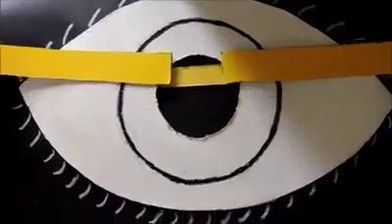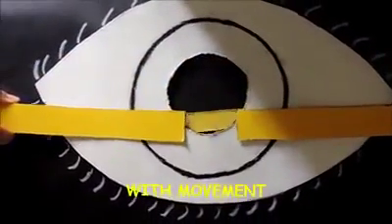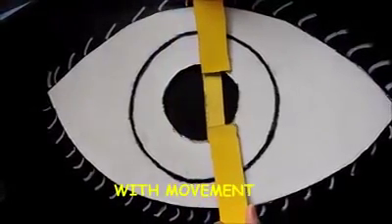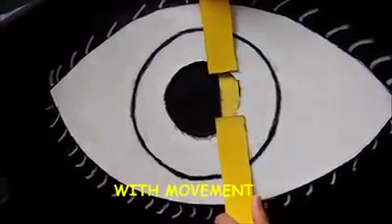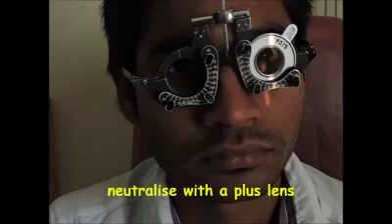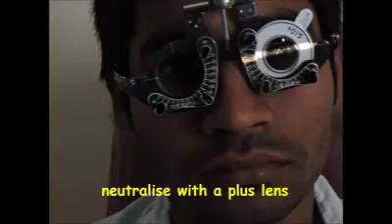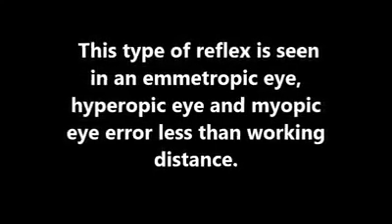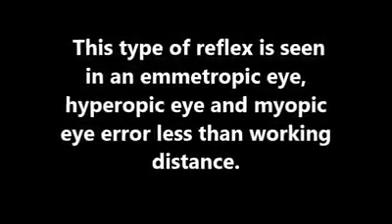Now, we check for the movement of the reflex, vertically as well as horizontally. If the movement observed both horizontally as well as vertically is a with movement, that is, the pupillary reflex moves along with the streak of the retinoscope, we neutralize this type of reflex with the plus lens. This type of reflex is seen in an emmetropic eye, hyperopic eye and a myopic eye which has an error less than that of the working distance.